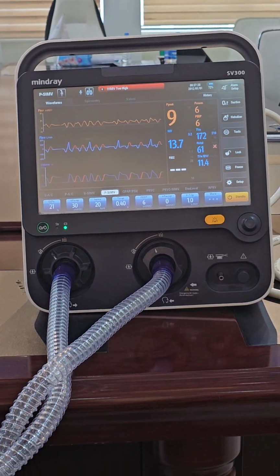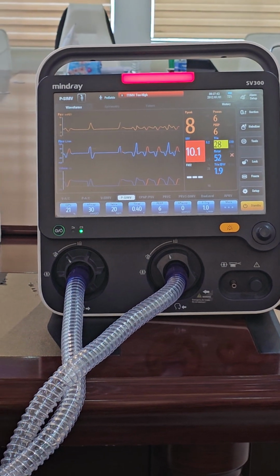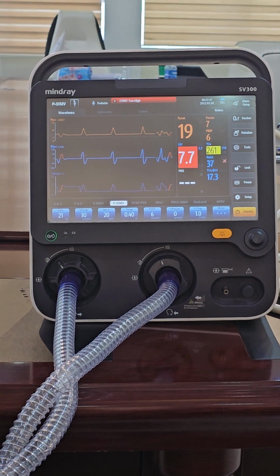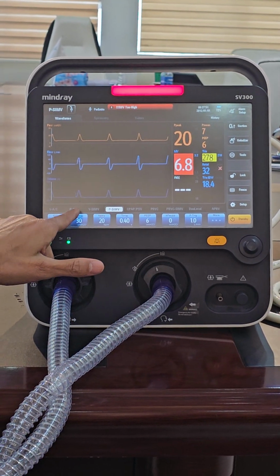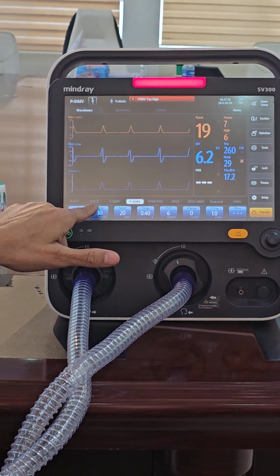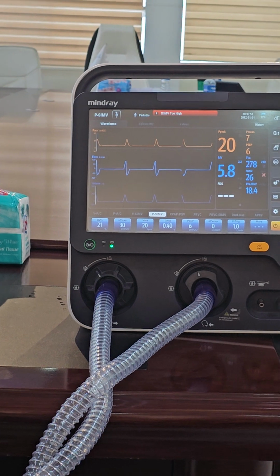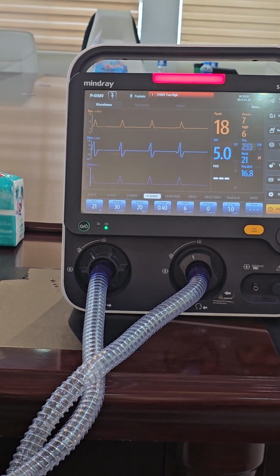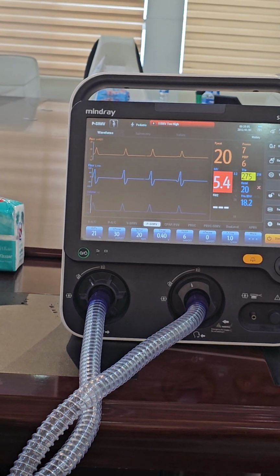So in this mode, we see what? Mandatory and spontaneous. We never see assisted, because it's intermittent mandatory ventilation, SIMV. It's a mode below the AC. It's the mode where the patient is contributing. So we give less support to the patient. Why? Because the spontaneous breaths the patient has to do by himself. He will never be supported. So it's more difficult on the patient.